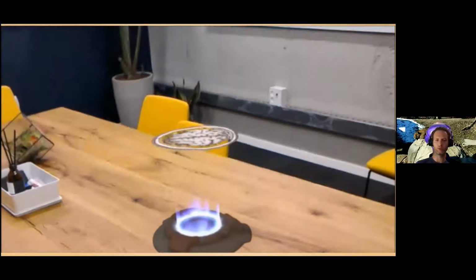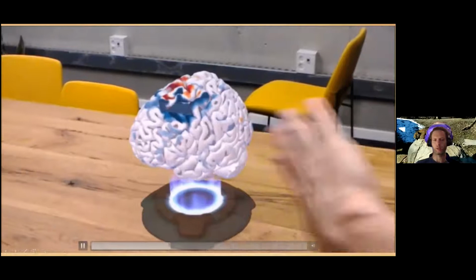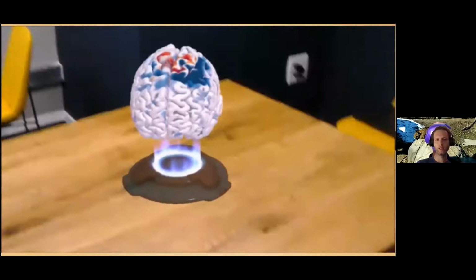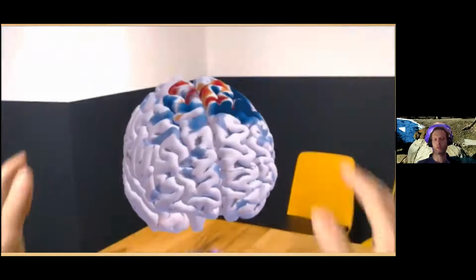The same 3D plane that I already showed you appears, and you can interact with the brain. So you can remove a hemisphere. You can see the invasive electrodes here. In the future, you'll be able to click like I just did in the MMVT platform. And you can also zoom in. So the idea is that we'll be able to dynamically stream the data from MMVT to the hologram, and the clinicians will all be able to interact and see the same object, even remotely.